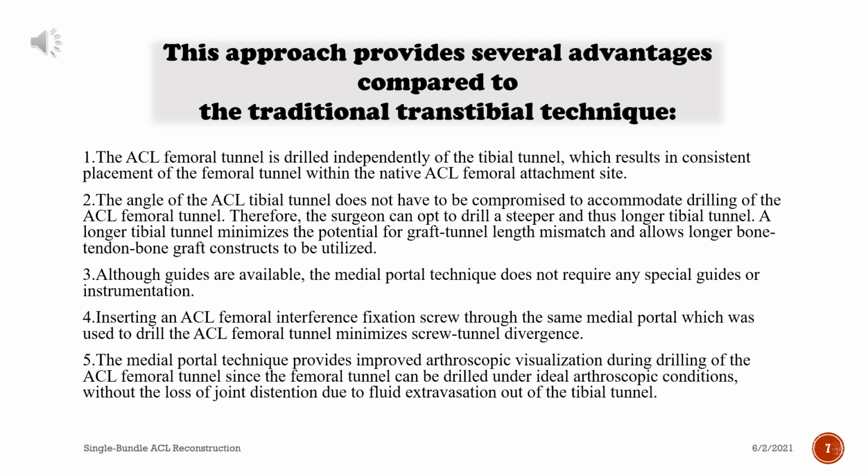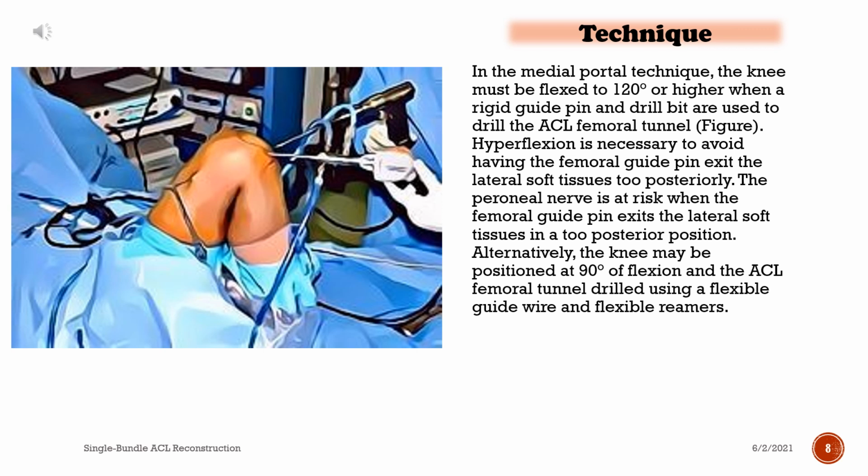The medial portal technique provides improved arthroscopic visualization during drilling of the ACL femoral tunnel since the femoral tunnel can be drilled under ideal arthroscopic conditions, without the loss of joint distension due to fluid extravasation out of the tibial tunnel. In the medial portal technique, the knee must be flexed to 120 degrees or higher when a rigid guide pin and drill bit are used to drill the ACL femoral tunnel, figure.